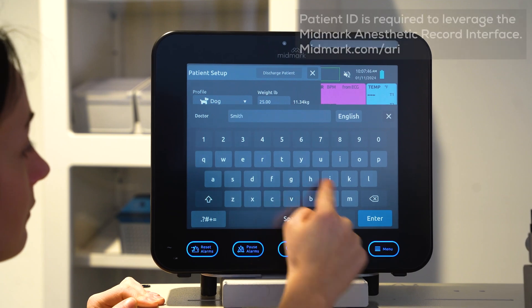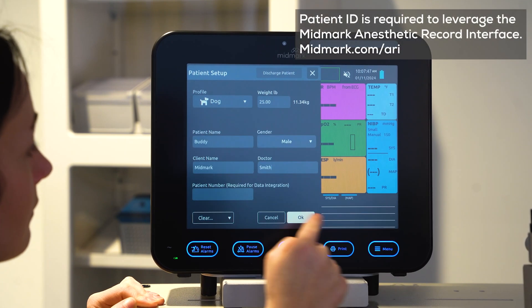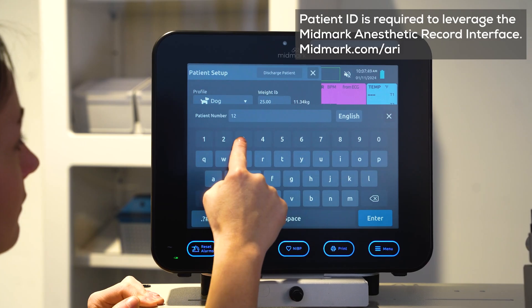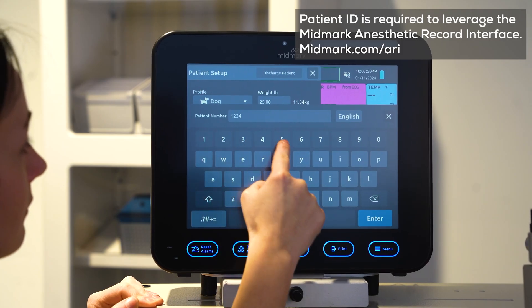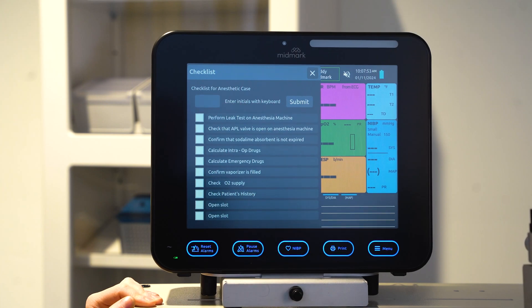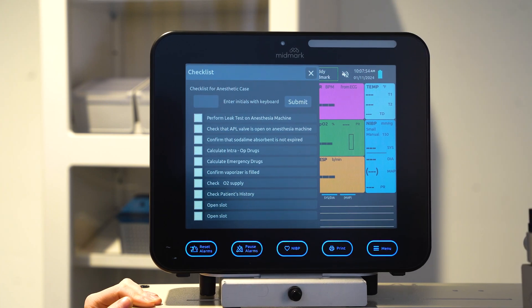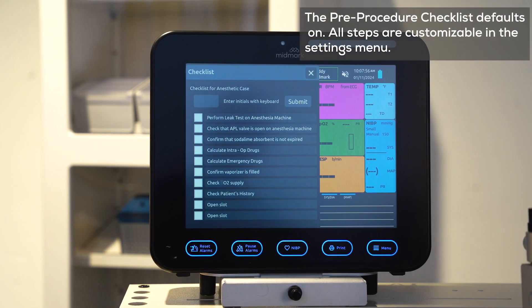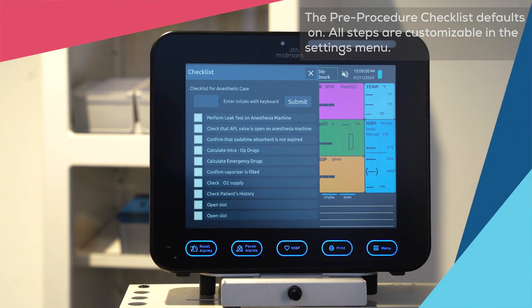The patient ID is required to use the Midmark anesthetic record interface. Press OK to save the information. Each time a new patient is admitted, the on-screen pre-procedure checklist will display.